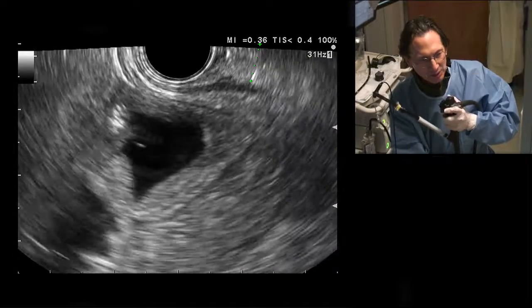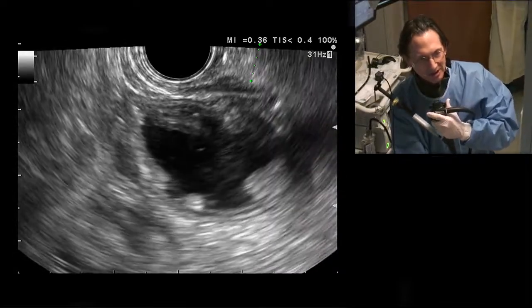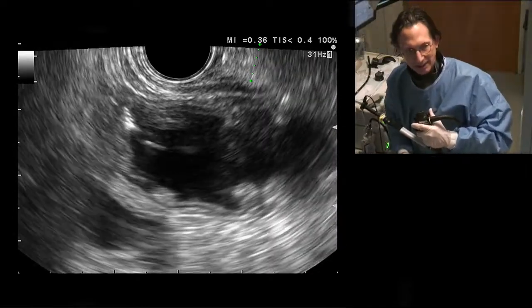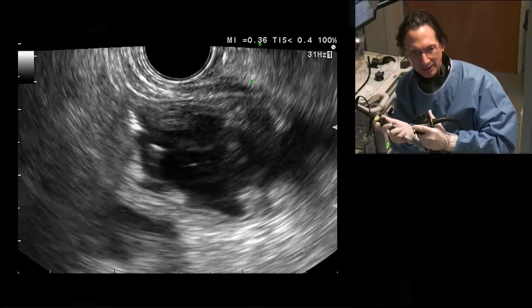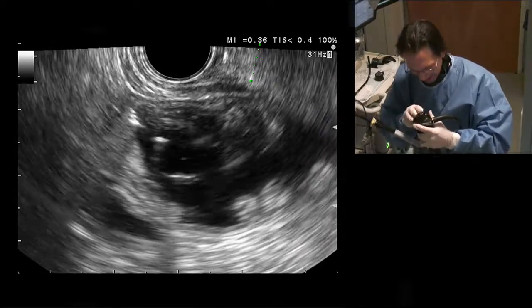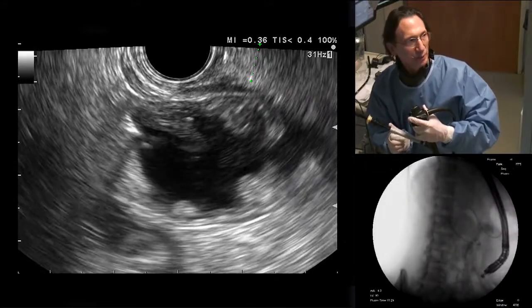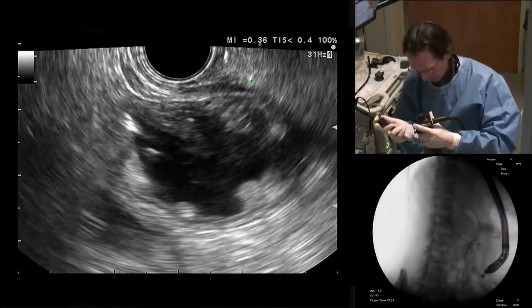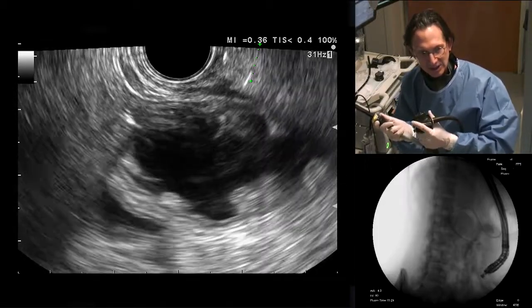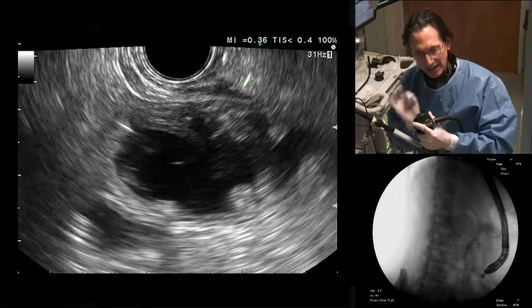The challenge with the small bowel is there's peristalsis, it's always contracting. This I like. We have the option of always giving a little bit of water to help fill the room, and we'll just step on the fluoro to confirm where we are, just in case we need to go back to the fluoro image. There's our fluoro. We've got to make a mental note. You see the AXIOS tip? I really like this position. I think we're ready to go.